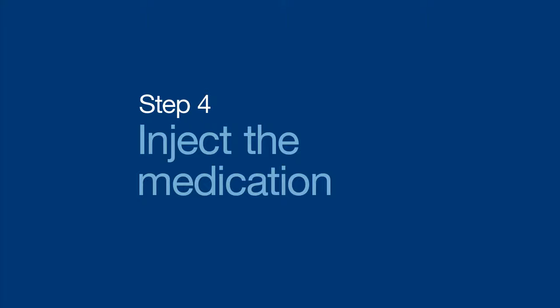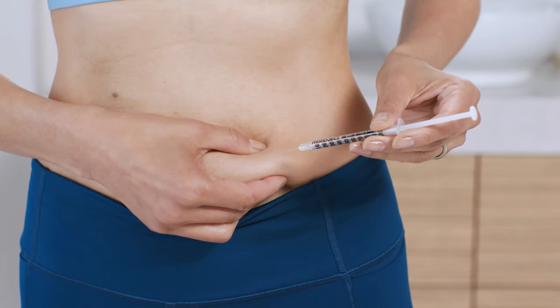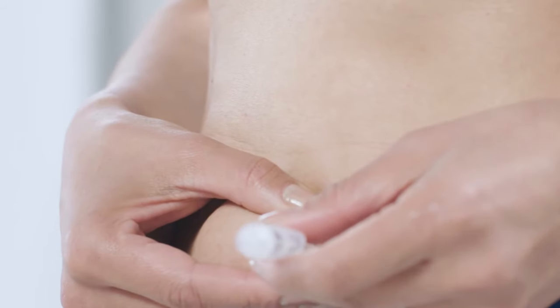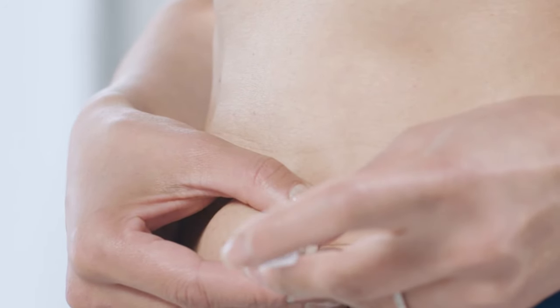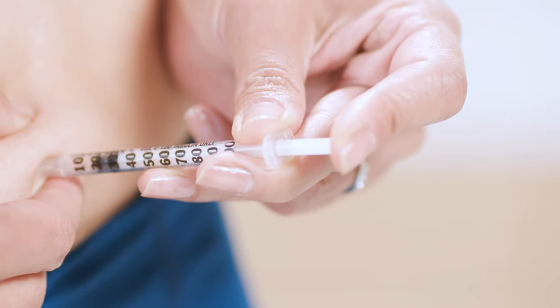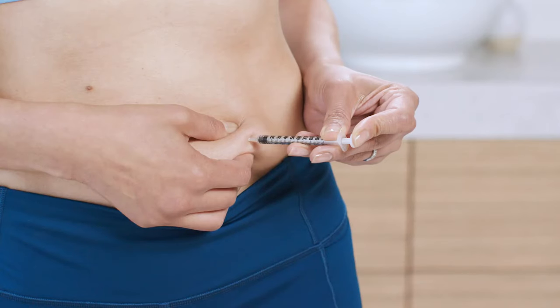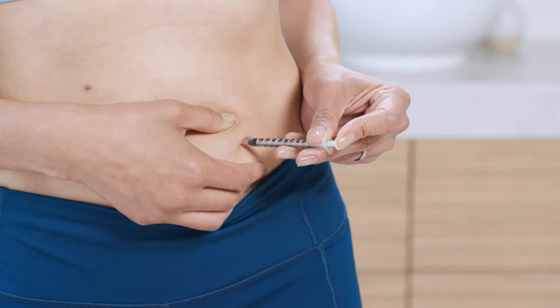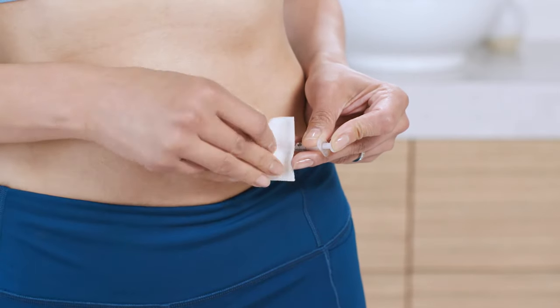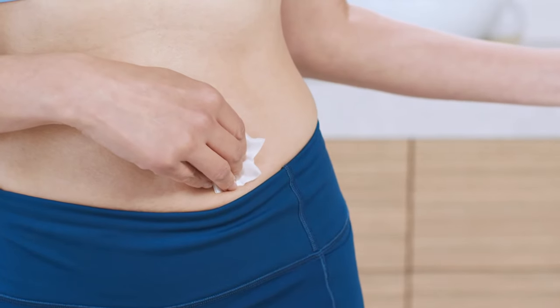Now you're ready to inject the medication. Hold the syringe in one hand and with the other hand, pinch a fold of skin around the injection area. Insert the entire needle straight into the skin at a 45 to 90 degree angle. Slowly push the plunger until you've injected all of the medication. Do a quick count of one, two, three, and then let go of the skin you're pinching. Press down firmly on the injection area with a gauze pad and remove the needle. Nice job!